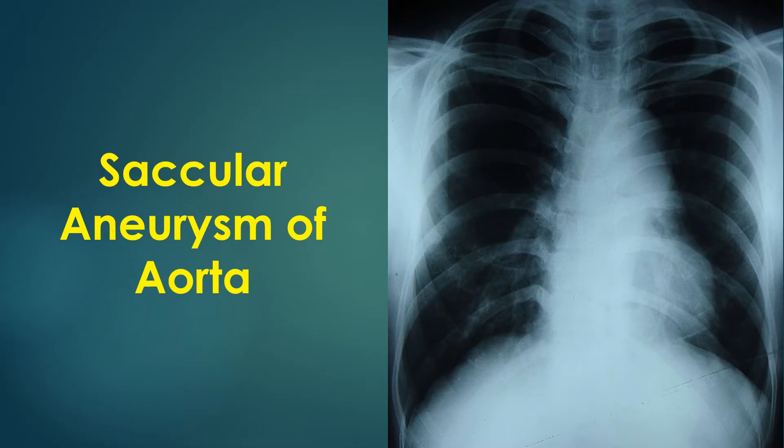The cardiac size is normal and so is the ascending aorta. The findings on this chest X-ray are quite subtle, so as to be missed by a casual examination. Similar findings may sometimes be noted in the elderly with atherosclerotic changes in the aorta without much aneurysmal dilatation.